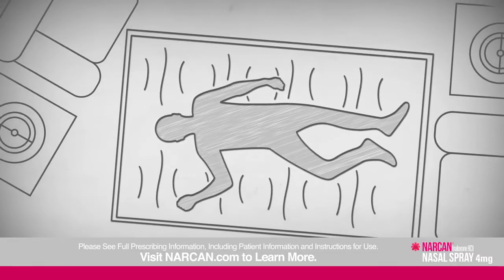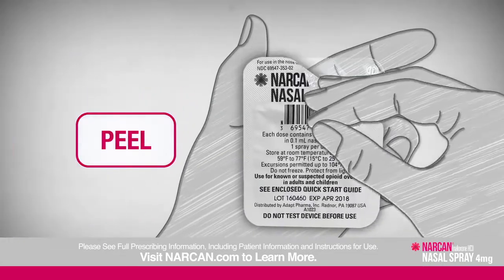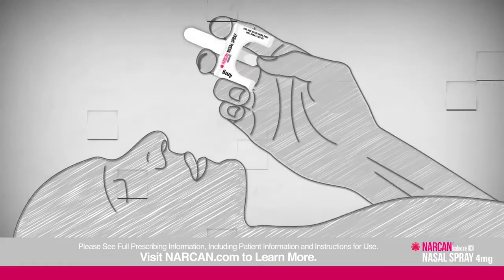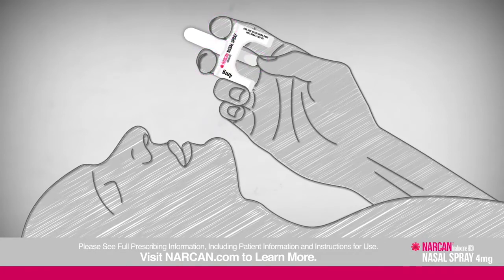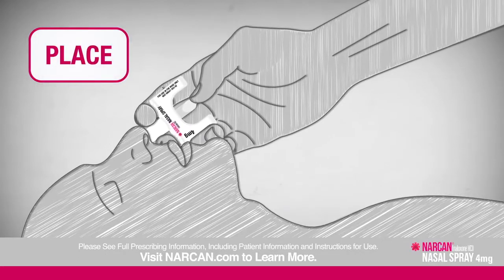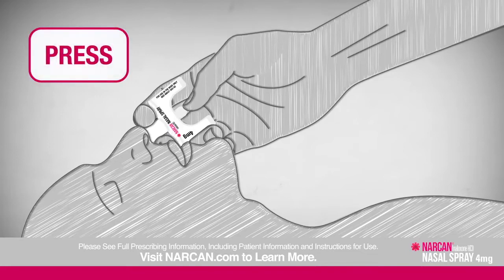First, lay the person on their back. Then remove the device from the box and peel back the package. Hold the device with your thumb on the bottom of the plunger and two fingers on either side of the nozzle. Tilt the person's head back and provide support under their neck with your hand. Place and hold the tip of the nozzle in one nostril until your fingers touch the bottom of their nose.